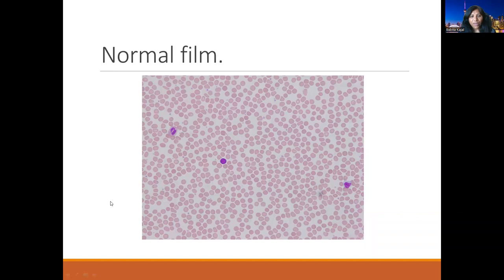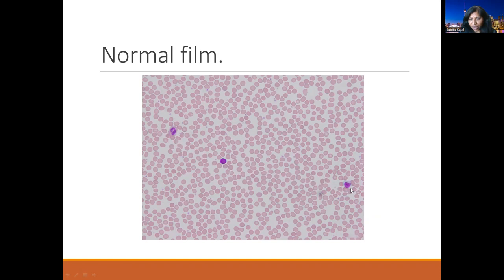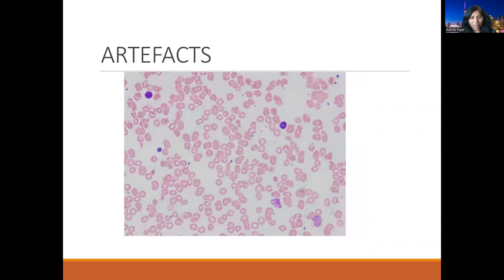This is a normal blood film. Here you can see all those RBCs — they are touching each other but not overlapping. In the background, small platelets are evenly distributed and not forming any clumping. We also have neutrophils and lymphocytes. The nucleus of this small lymphocyte is almost similar in size to an RBC. This is a large granular lymphocyte. So this is a normal film.